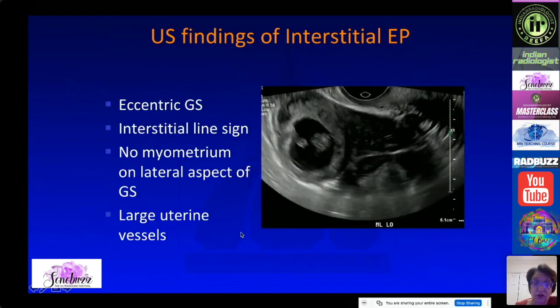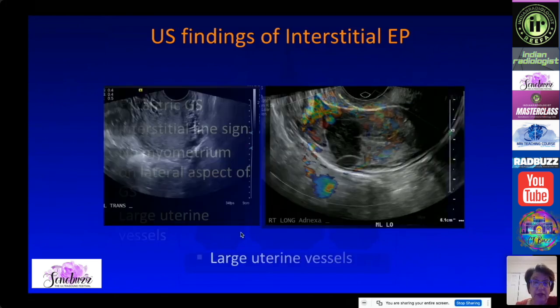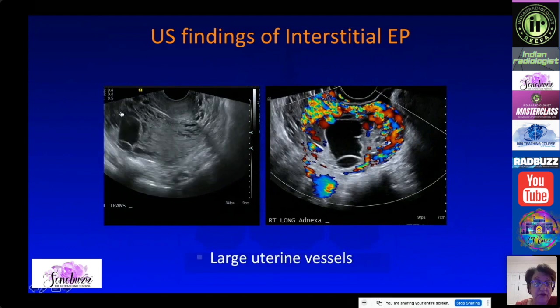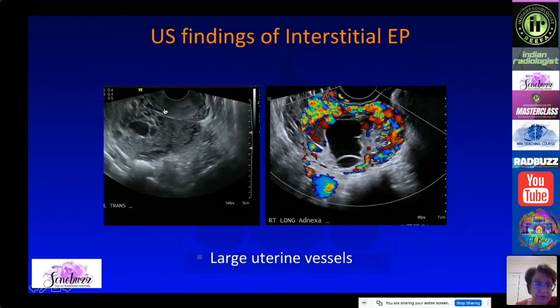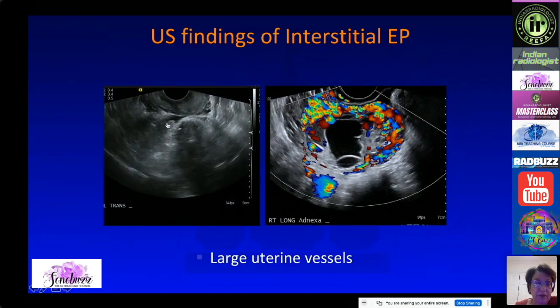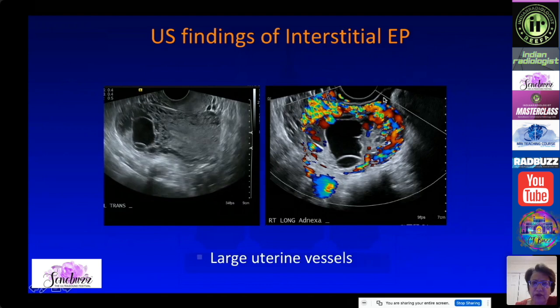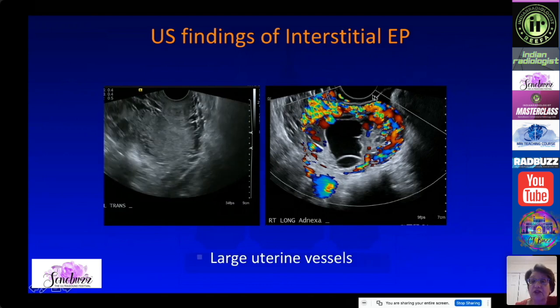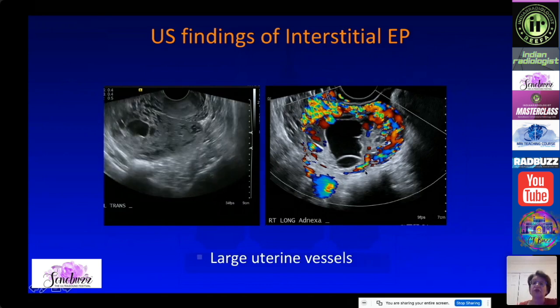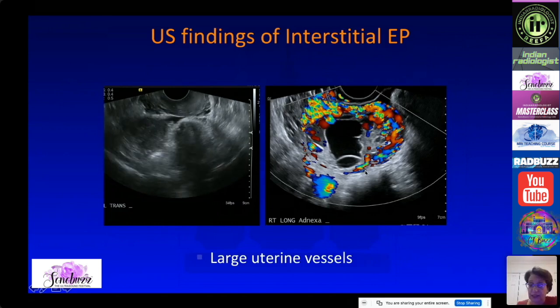In another patient you can see the ectopic pregnancy with very large vessels nearby. You can imagine that if they rupture, the patient is going to become hypotensive very quickly.